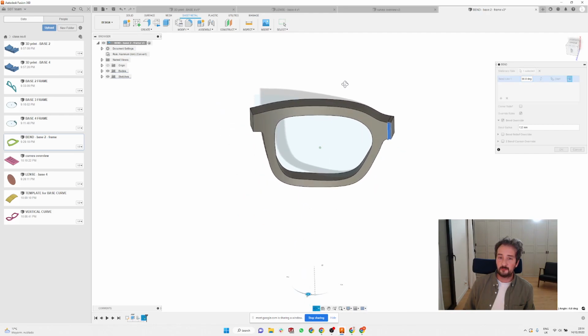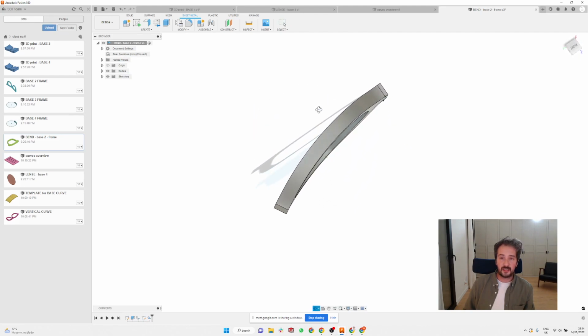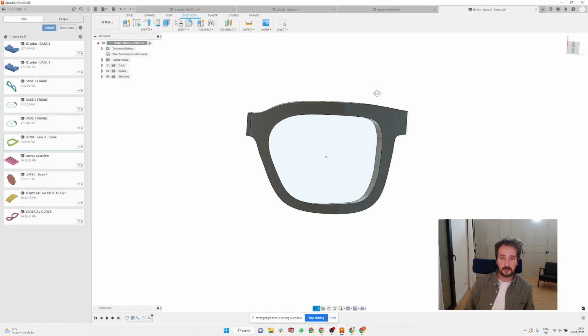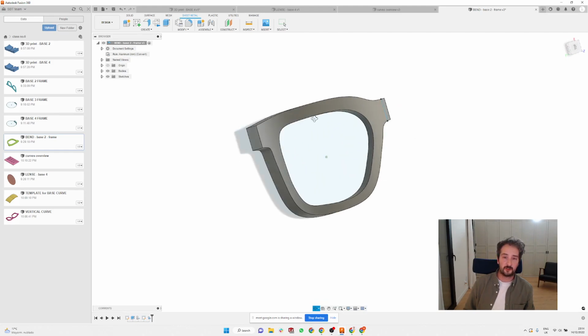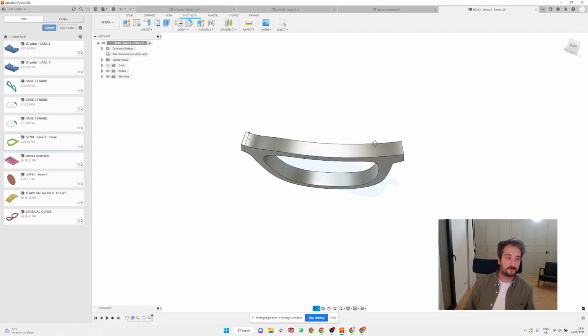And it's basically giving me this curve. You can see now it has the vertical curve of the lens. It doesn't have the horizontal. You can see this is still flat, but it has at least this bend.